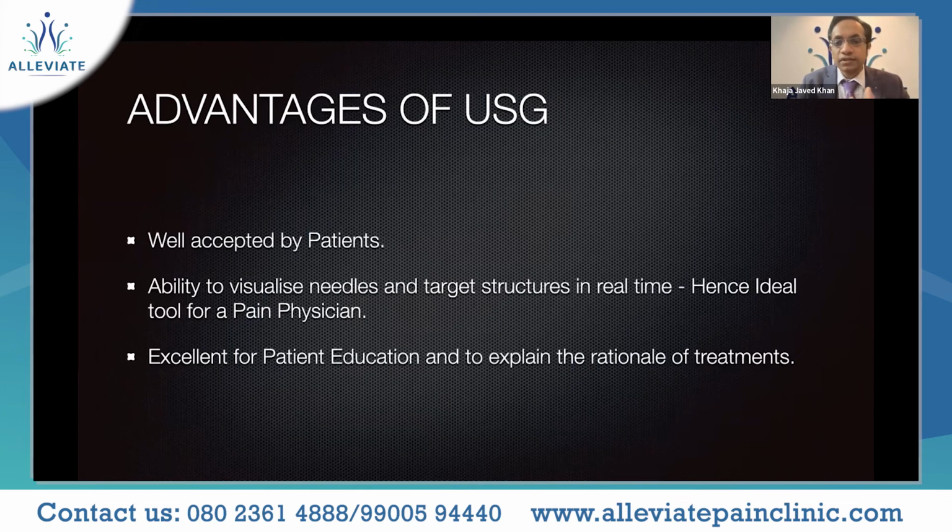It gives us the ability to show the sonopathological conditions. For example, if someone is having a suprapatellar bursa or knee osteoarthritis, you can use the ultrasound and show it to the patient as well.